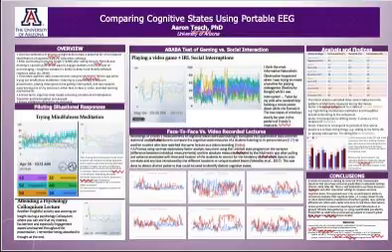So for the person watching it on video, you can tell that towards the end of the lecture, there was a spike in a couple of the measures. And I had interviewed this person, and they actually mentioned that they got more into the lecture as it went on. So that was a verbal validation that there was something measuring their conscious interest in the topic that correlates with the measures that we see.